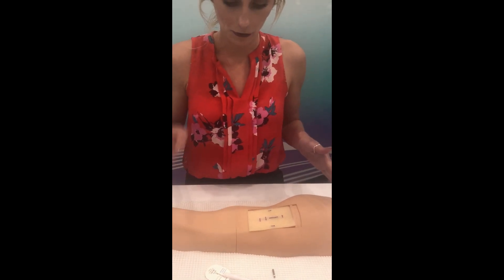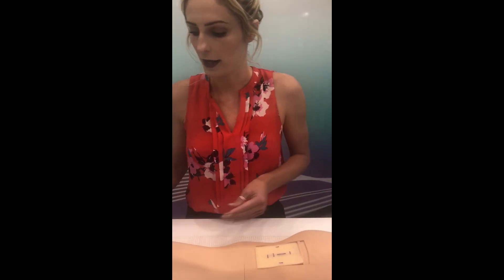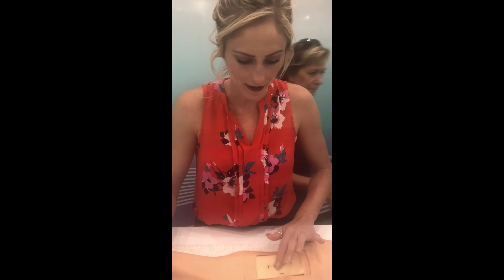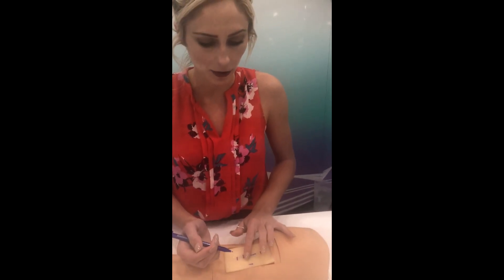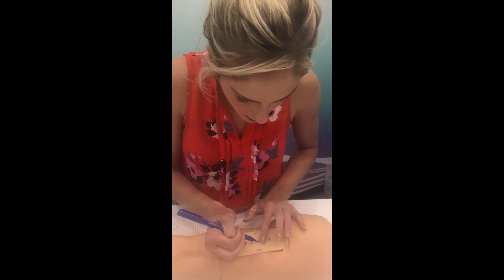So now we're going to removal. We're going to do lidocaine again. First you want to mark the distal end and the proximal end — because it's 90 days later, so I'm feeling it. 90 days later I feel it, and then I mark the distal end and the proximal end.